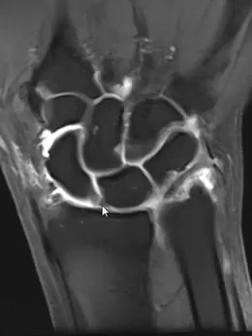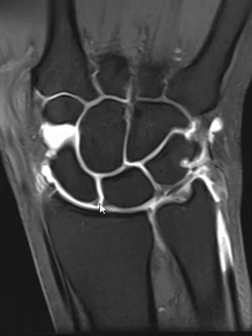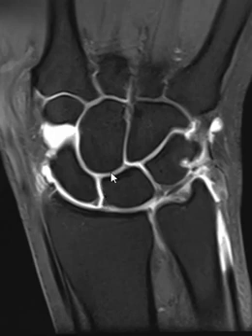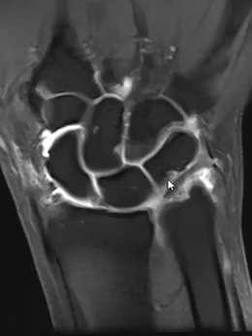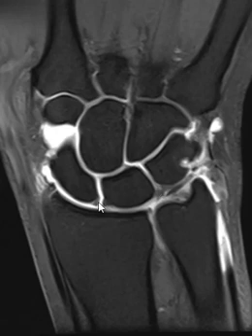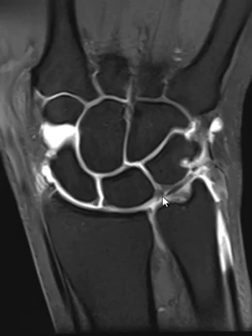I'm going to put up an axial view, but first I want to show you one more thing — the scapholunate ligament. This is the scaphoid bone, this is the lunate bone, and right here you see a fluid-filled gap. The scapholunate ligament is completely torn, and we see contrast going up through that into the mid-carpal compartment. Over here is the lunatotriquetral ligament, and I don't see this widened, so I think that one is okay. But there is a definite tear of the scapholunate ligament, and again a large complex tear throughout almost all the triangular fibrocartilage.